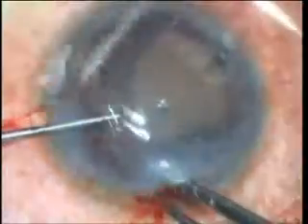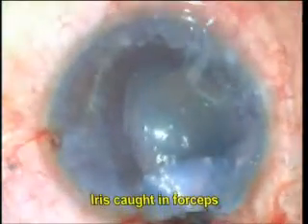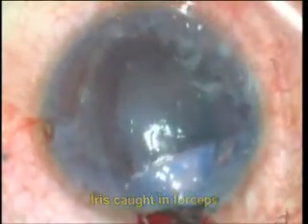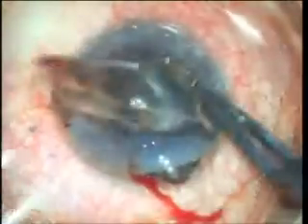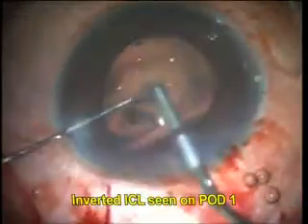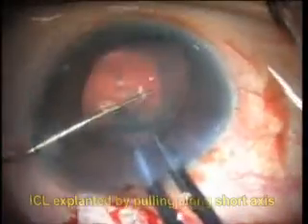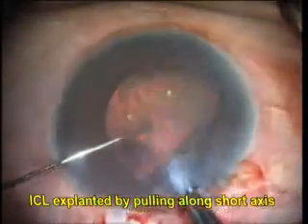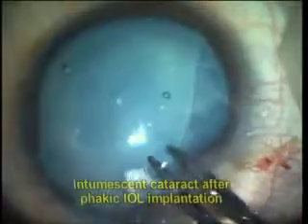The incision need not necessarily be enlarged for explantation of an ICL. However, care should be taken not to damage any intraocular structures during explantation. If required, the incision may be enlarged slightly. Since the material is extremely flexible, it is easy to simply pull the ICL out of the incision as seen in this case, where it comes out easily despite not being pulled out along the long axis.